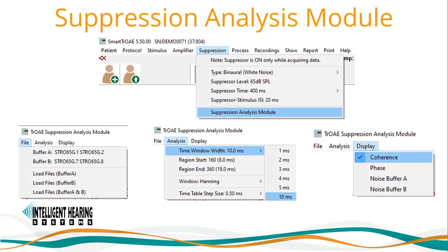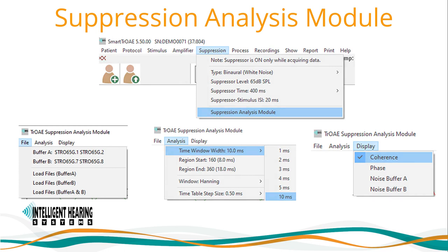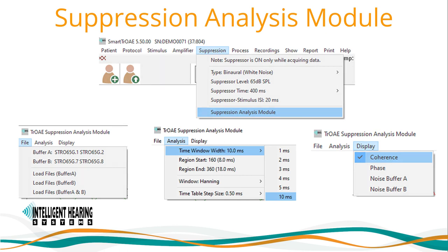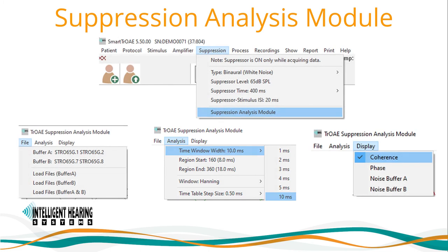Once the data is acquired on the main screen, you can go to the suppression menu to access the suppression analysis module. Within this module, you can load recordings from the file menu into two different buffers for comparison. Suppression analysis is typically done within a 10 millisecond window set from 8 milliseconds to 18 milliseconds. Analysis settings can be set in the analysis menu. There are various display options including response comparisons, coherence, phase, noise buffers, and frequency and time tables.